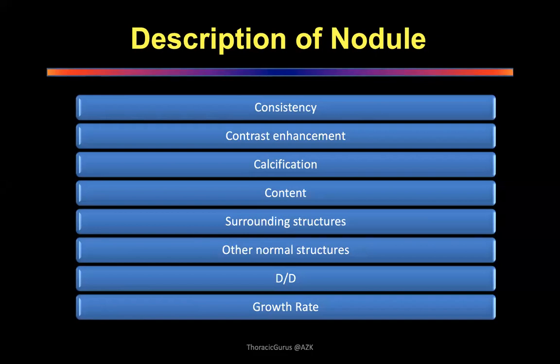And then don't forget to ask for previous scans. It's very important at the end of this to say, I would like to see the previous scans, because you want to talk about growth rate. You do want to know whether that pathology has changed in size or not changed in size. Okay? So these are very, very standard, nothing complicated, very straightforward stuff.